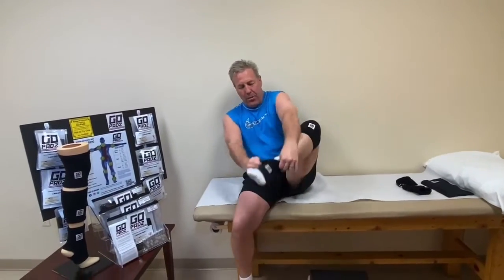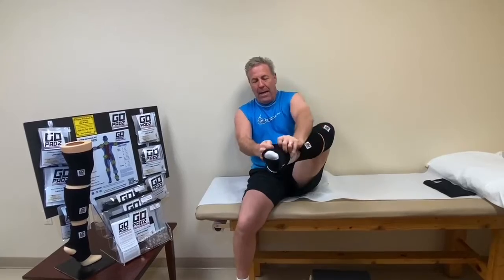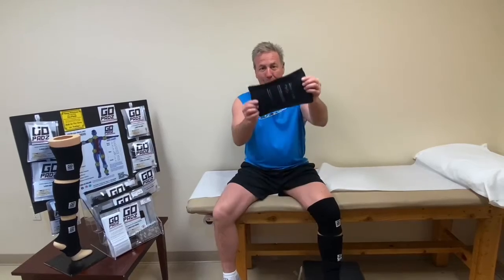I'm going to show you — I put this wrap on above my knee, and I have another one for my calf, and even one right here for my ankle. So my full leg is covered.